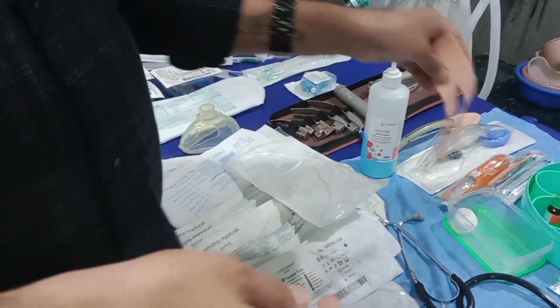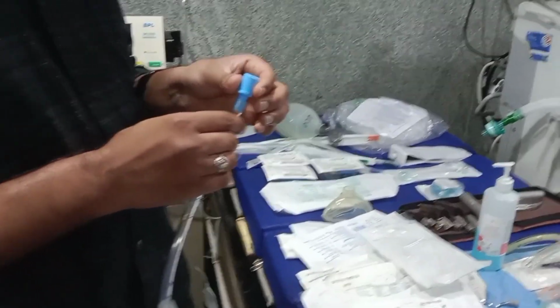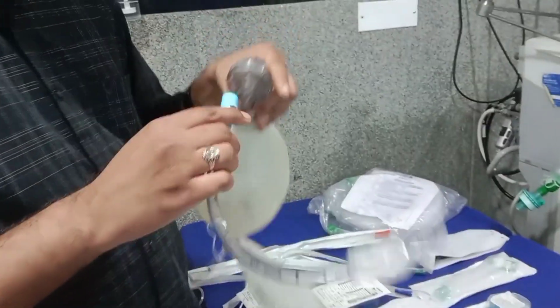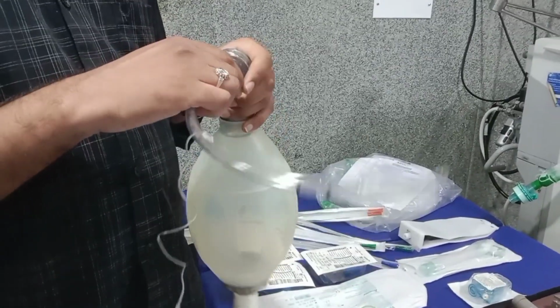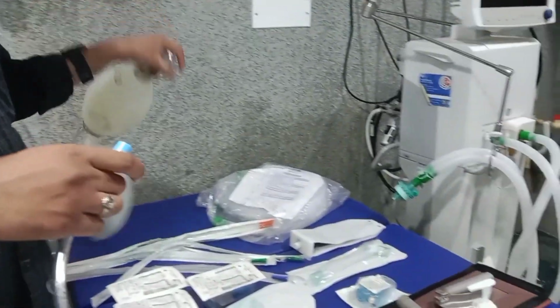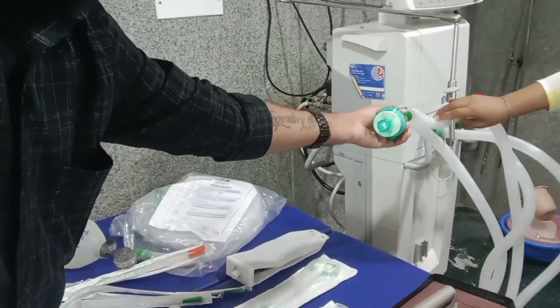Once the tube is fixed, it can be connected to ambu here like this. Once doing ambu, once we achieve the required amount of saturation, once the airway is secured, we can connect it to the ventilator circuit.